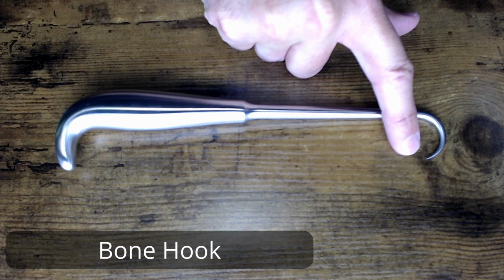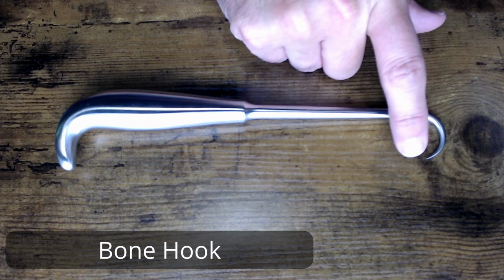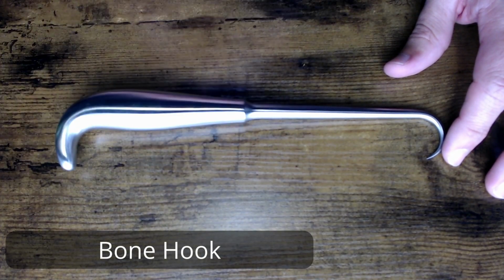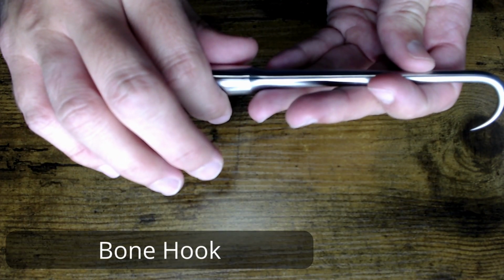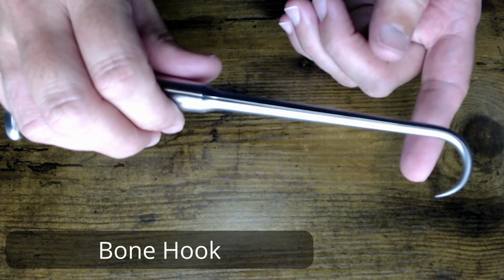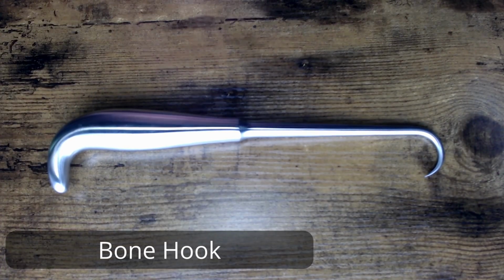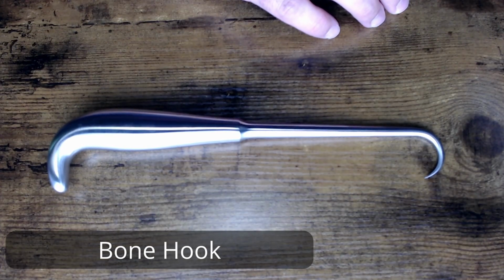Interestingly enough, you want to pay special attention to the tip of the hook, because this is a sharp risk in processing trays. Anytime you got a hook or a sharp on one side and the other side of the instrument is weighted in the way that this handle is, this is an easy one to pick up, and then during the reprocessing process, it slips down somehow and gets you. And you see it actually almost got me right there as I was showing you. So you want to be very, very careful with your bone hooks, with your skin hooks in particular too, because they're sharp for a reason, and even on the clean side they can do a lot of damage if you're not careful. So this is the bone hook.